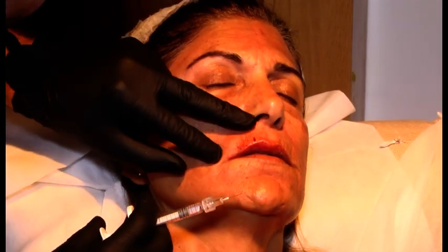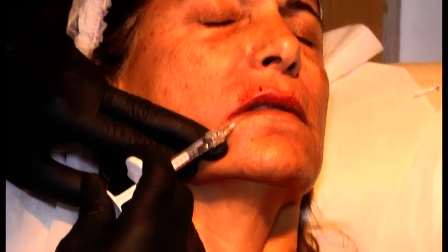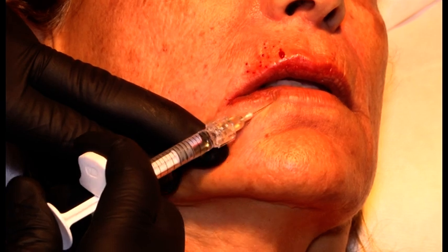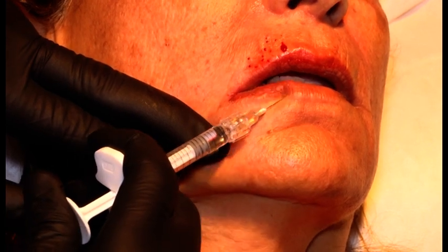Another way of doing this is going from below into the lip, low into the lip, and this is also giving hydration.